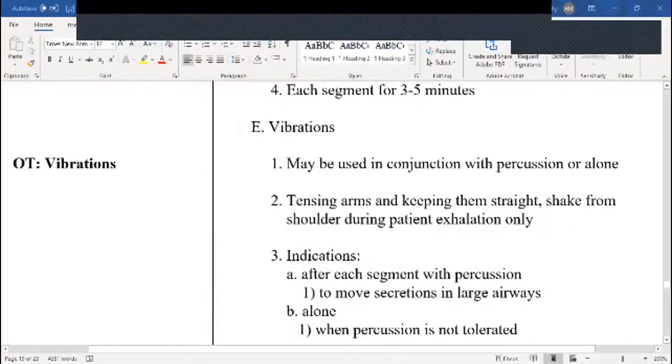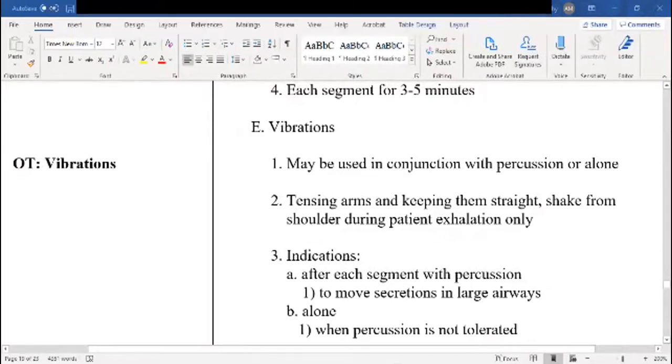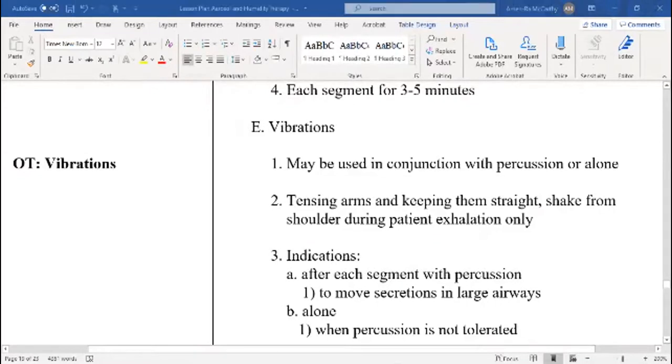When they exhale, we want to shake, shake, shake. And now we've got devices that do that for us, so we don't really have to. They can blow into a device and it will shake, right? Somebody said, I ain't doing that all day, let me come up with something. And now they're millionaires, okay? Respiratory therapists, all right.